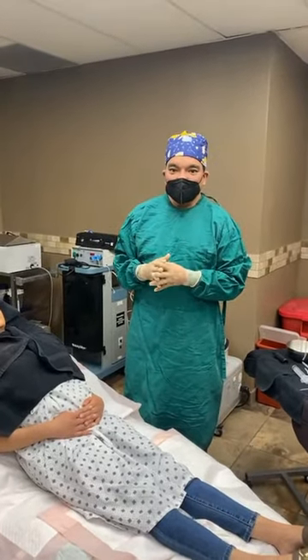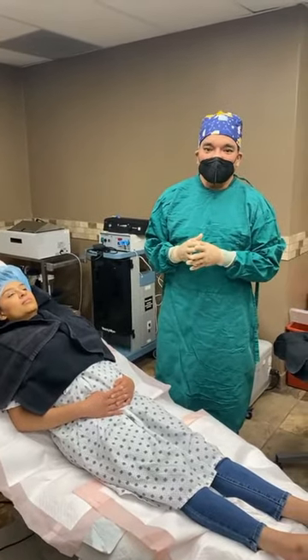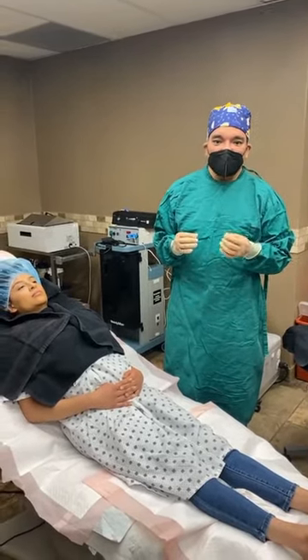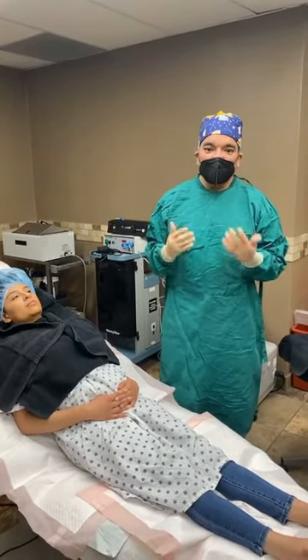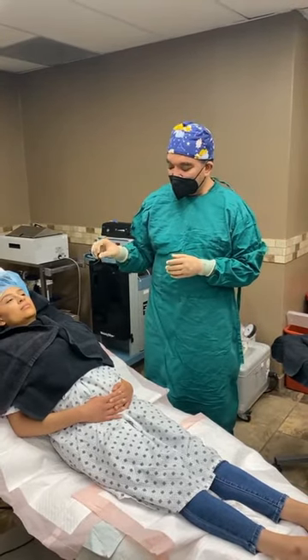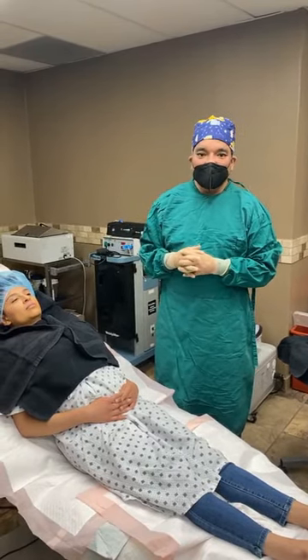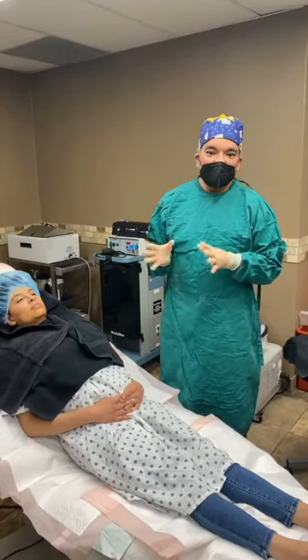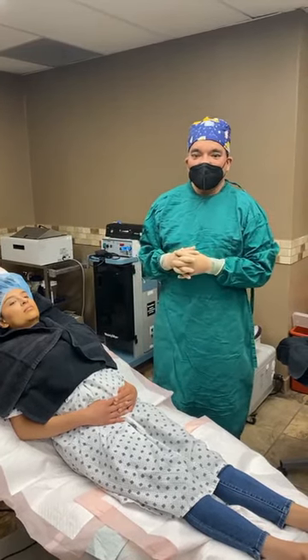Now, as a point of reference, if you've ever seen Dr. Pimple Popper, when she does her lipoma removals, she generally will use a tumescent solution, which is what we're using today as a modification. Now, this can be done by a simple cannula to suction off the fat, but I'm going to use the suction machine today simply because I'm going to use a little bit more anesthetic to distinguish certain areas of her jawline and her neck. Because you have to be very careful in these areas, especially when there's not a significant amount of fat that has to be removed.